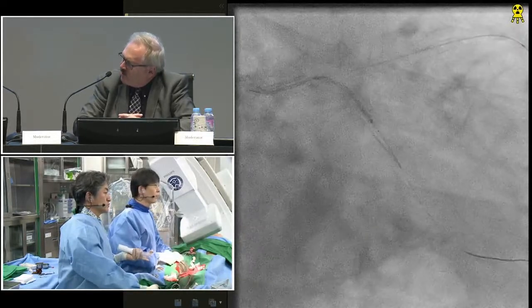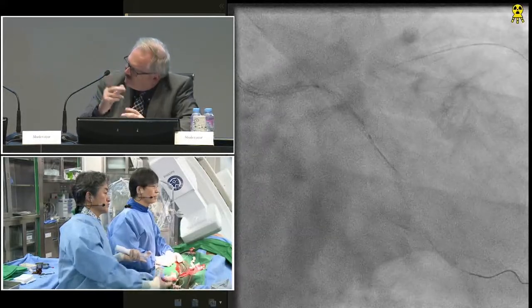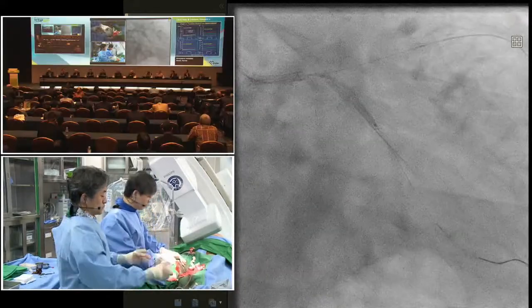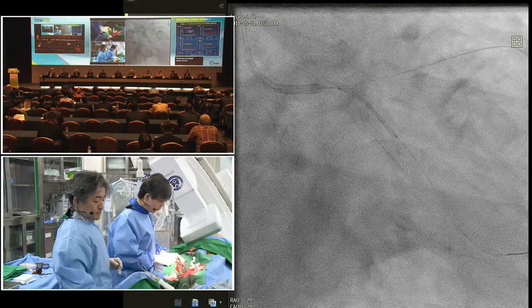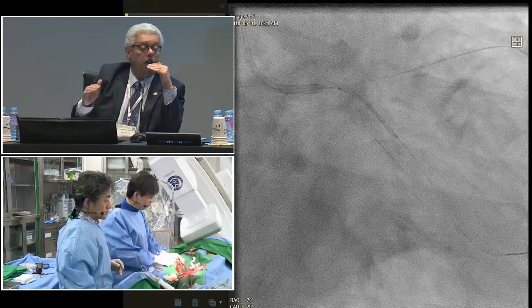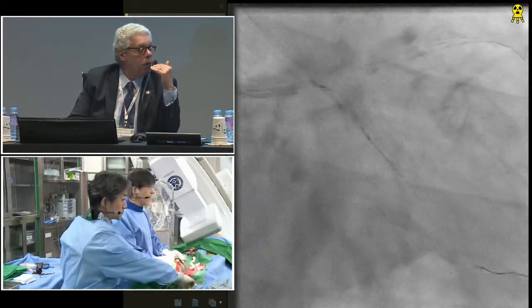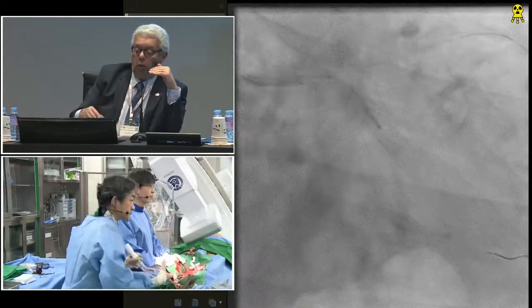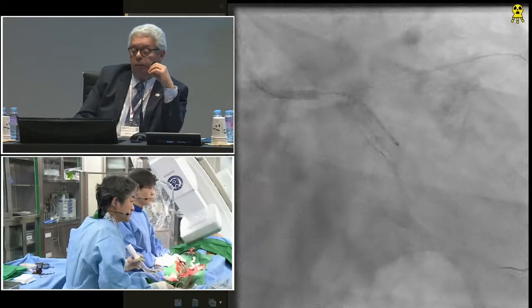Any comment from the panel? I see somebody who agrees with that. Any comment? I think we can use the iFR to see at different levels which is the most significant situation, and the new Volcano method they have might be quite helpful.